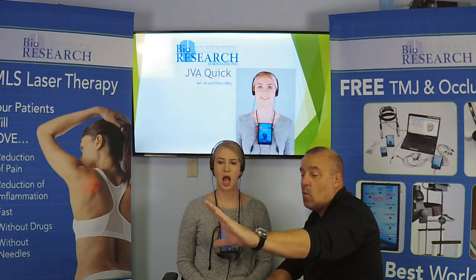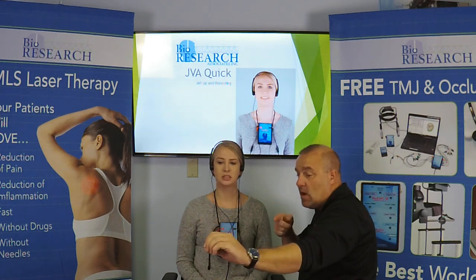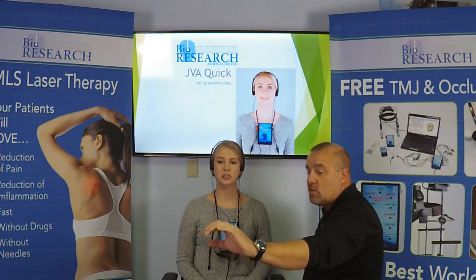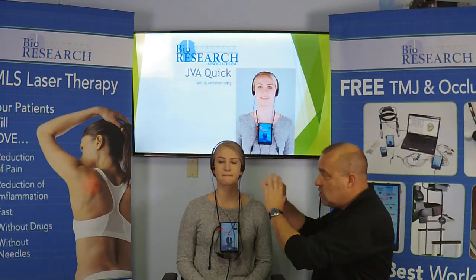Now what I'm doing as she's wide tapping, you'll see how I'm positioned. I'm looking at her out of the corner of my eye, and I'm watching the animation at the same time, making sure that she is in time with that animation. Once we fill the screen with data, I simply hit enter, and I have joint vibration analysis recorded. Now once we have it recorded, we can now take a bite registration. We could put any sort of a splint in that we want to test and immediately take another one. All we have to do is denote, is this natural bite, whatever splint we put in, whatever bite registration we took, and we can do an immediate in the office before and after comparison.